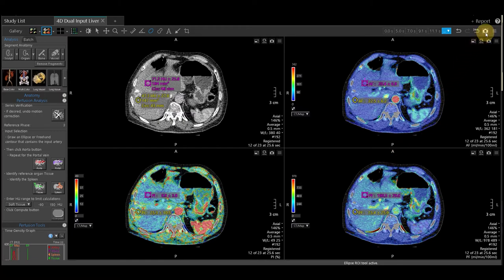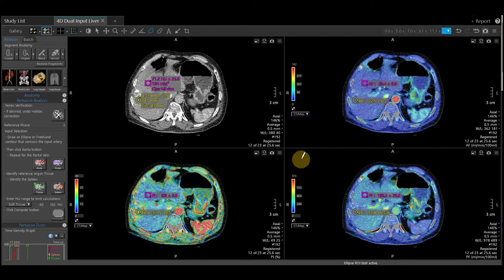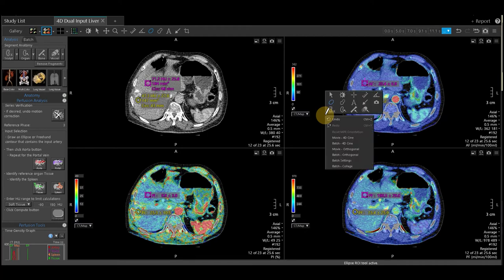To save these images, a snapshot in the main toolbar will save all four of these images. If you would like a collage that will save this entire page through the entire data set, that is located on your right mouse click under Batch Collage. You also have an option to batch this as a 4D Cine.